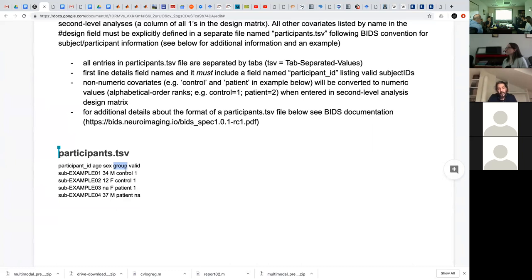But for those cases where you have groups and those groups only have 2 levels, so it's a categorical value that is nominal but only has two values, then it's the same to have a single variable or have 2 variables, 1 for each particular group.